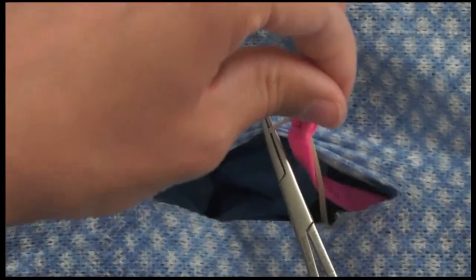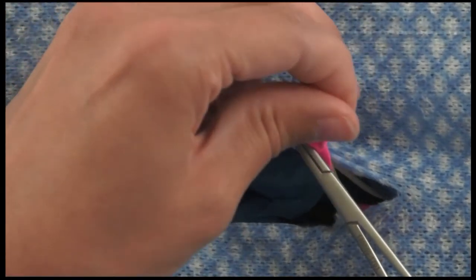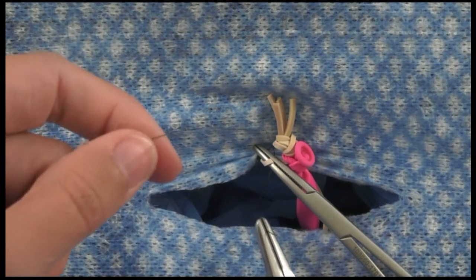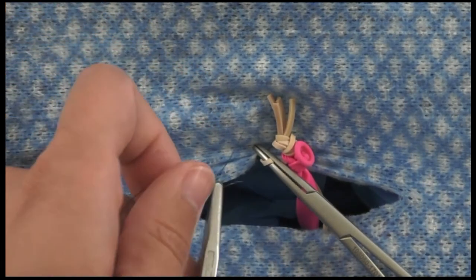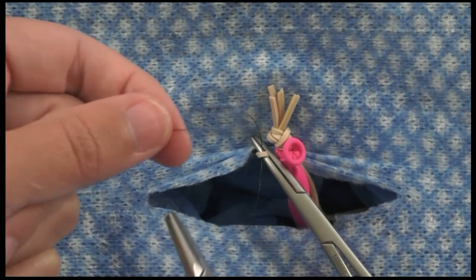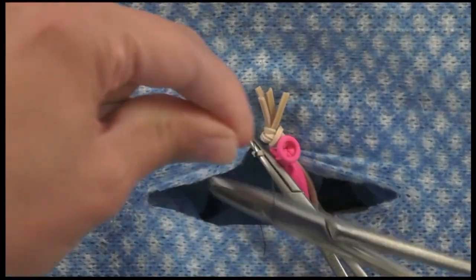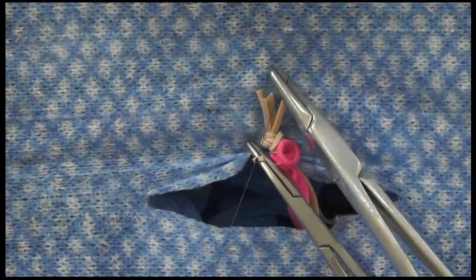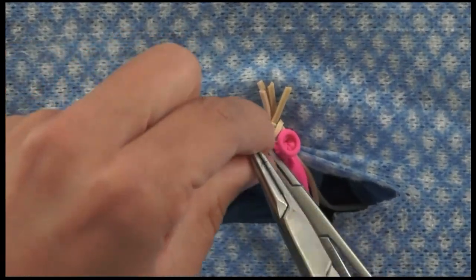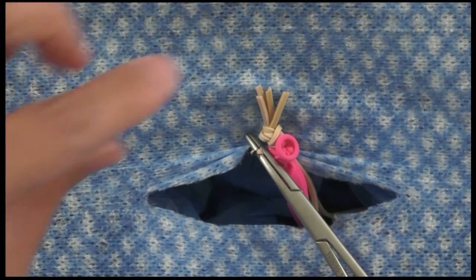Move your hemostat more distally toward your ovary and place the ligature in the crush bed where the hemostat was previously located. A useful technique: insert the hemostat with tips up, then rotate it so tips are down — this allows you to see exactly where you're placing your ligature and what you're ligating. If doing surgery alone, this is especially valuable, since an assistant would otherwise provide that visualization.